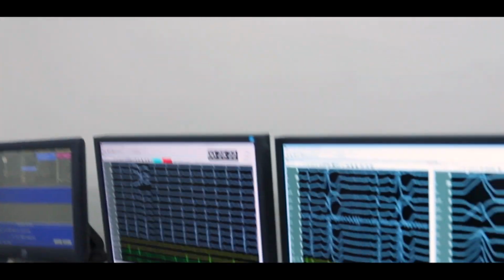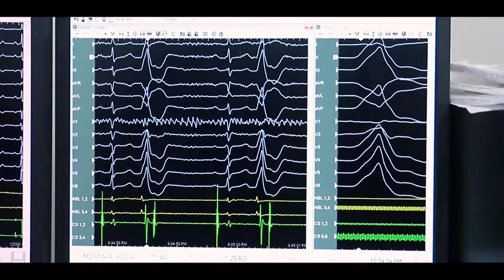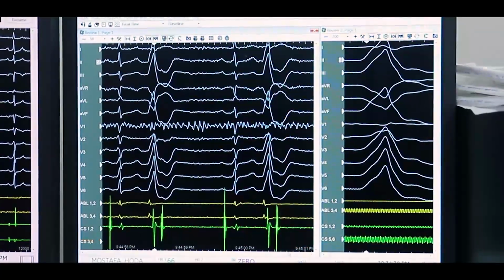Years ago, she underwent multi-slice CT coronary angiography, which revealed normal coronaries. As we can appreciate from the resting ECG, RSR' in V1. So this is a patient with high burden PVCs, very highly symptomatic, with normal echo and normal CT coronary. This is the 12-lead ECG of the patient.